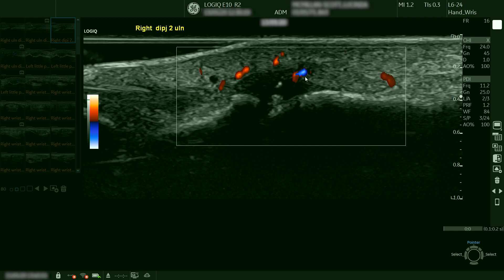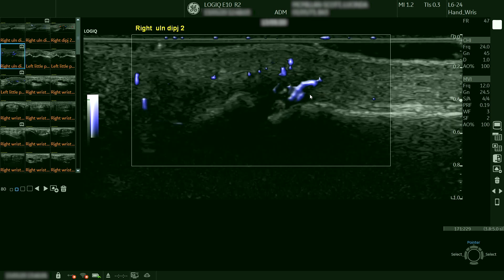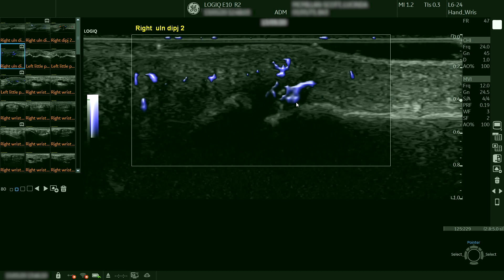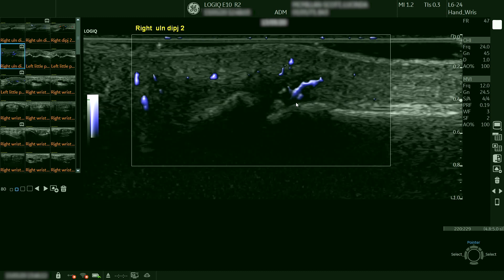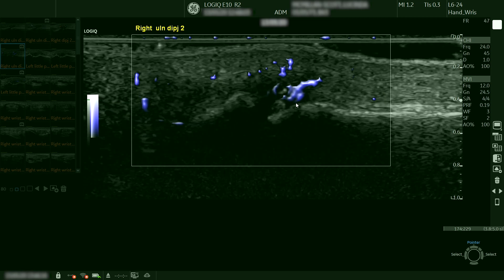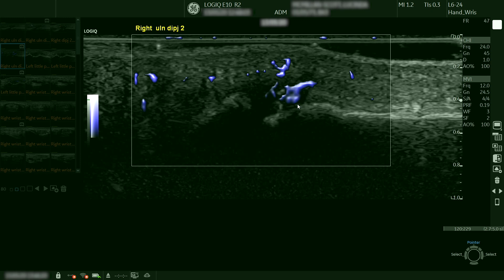With colour Doppler using radiant flow there is a small area of vascularity. When we apply the microvascular imaging we can see blood flowing within the erosion, which is very obvious and what we would expect to see with an active erosion, and we're getting much more detail with this application.